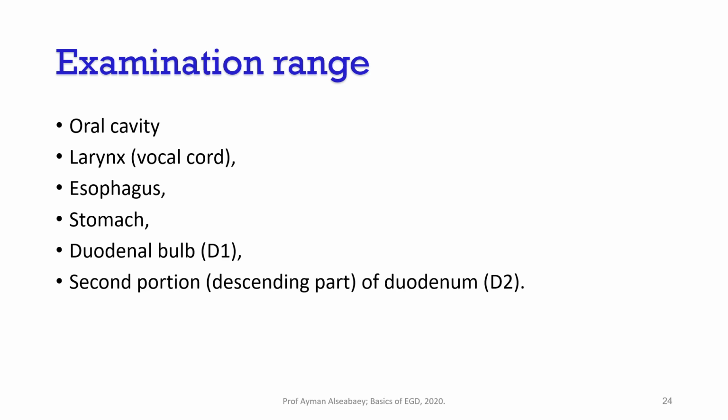As you know, in ERCP we enter the esophagus blindly. A few years ago, I did an ERCP for a patient, and after I finished stent fixation, I noticed that there was blood coming to the duodenum from the stomach. I pulled out the endoscope and I tried to see the source of bleeding, but I could not identify it. I brought our endoscope and I began to do an endoscopy for the patient. I found that there is a mass in the esophagus, but as you know, the ERCP duodenoscope is a side viewing endoscope, and it can examine only one fourth of the field, so we didn't see this tumor while negotiating the esophagus.